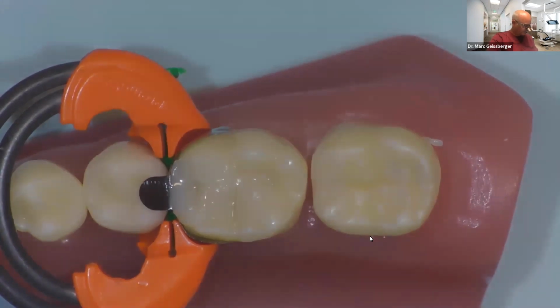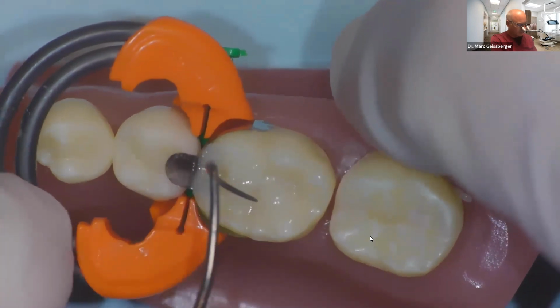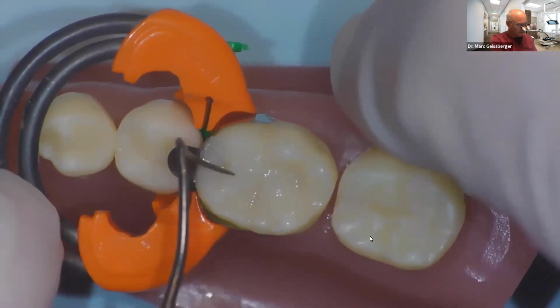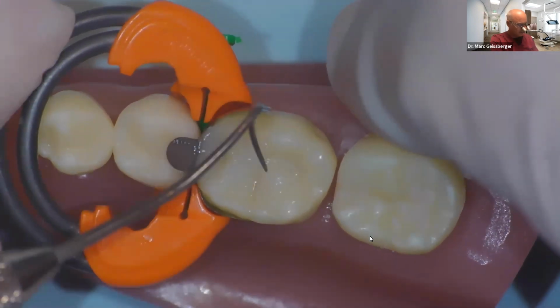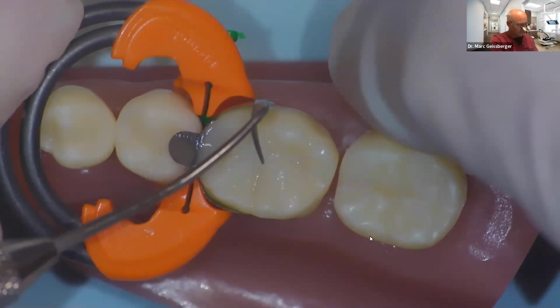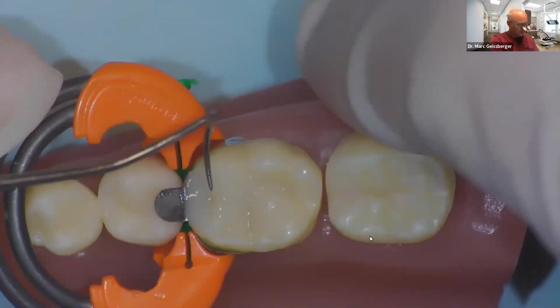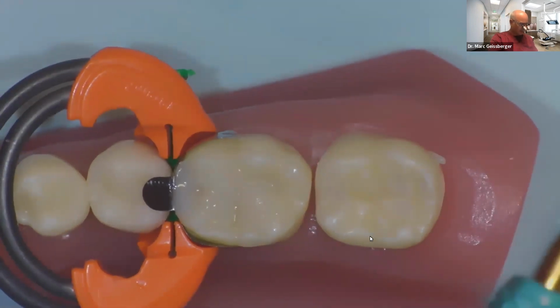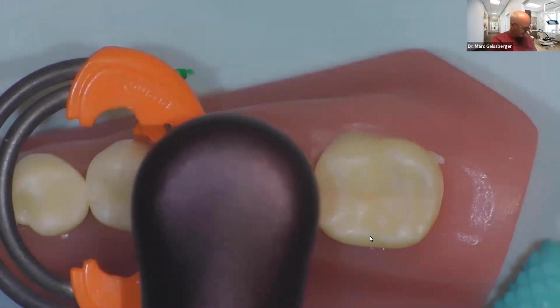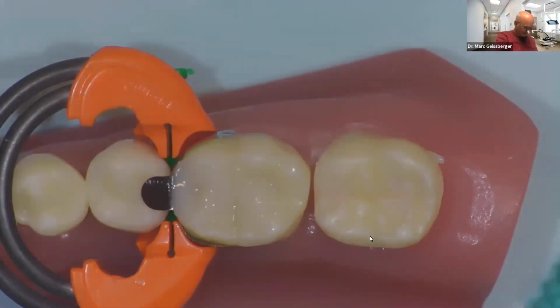Now what I can do is redefine my central groove coming through there. Okay, just using Explorer tip, no fancy instruments here. Get my anatomy set, triangular ridge set. And I love that we got a buccal groove there. Now we're going to light cure 5 seconds. Now, when you think about it, I cure for 5 seconds. The mesiolingual cusp just got its 10 seconds.